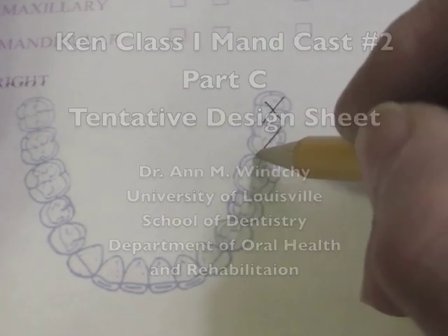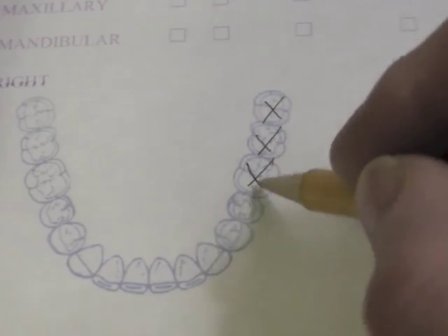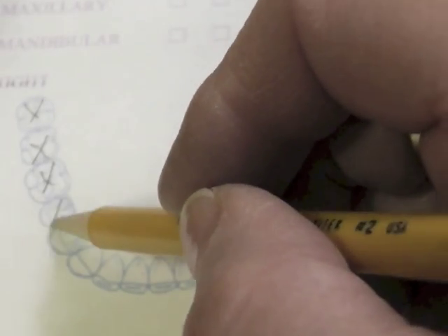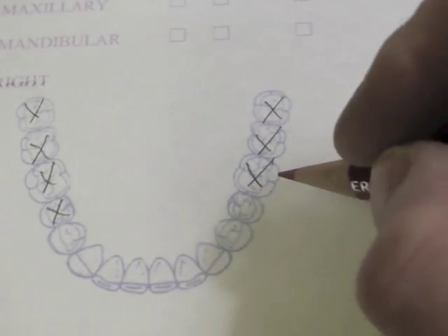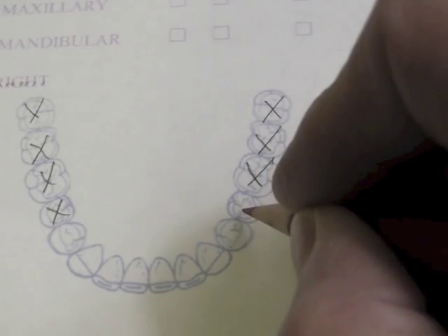First thing I'm going to do is mark out my missing teeth on this particular cast. My molars are missing on this side, and my molars are missing up to and including the first premolar on that side. We indicated that we want to use the I-bar because it is the clasp of choice on an extension base removable partial denture.